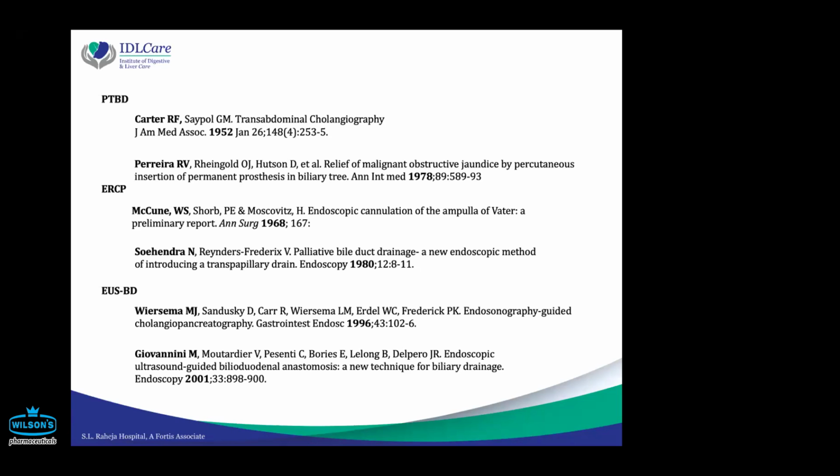ERCP arrived in the late 60s with McCune cannulating the papilla for the first time, and then Soehendra in 1980 placing the first transpapillary stent. It obviously revolutionized biliary drainage. It's almost now 5 decades that we are witnessing the growth of ERCP, and it has acquired a place which is called the gold standard for biliary drainage now.